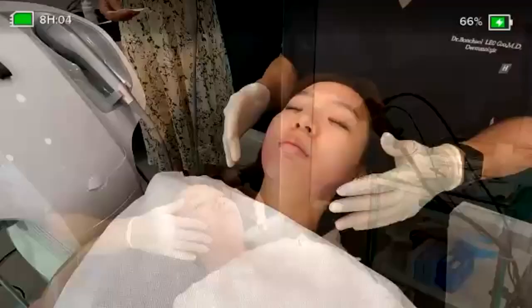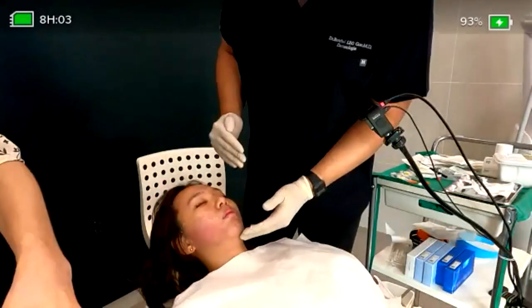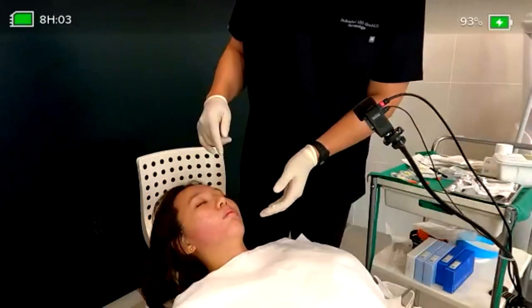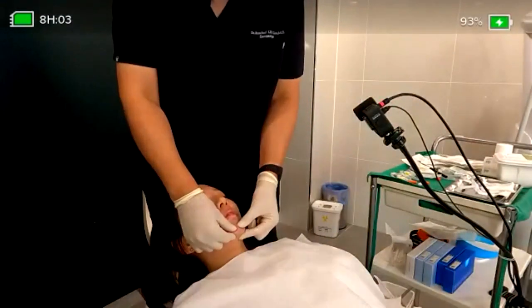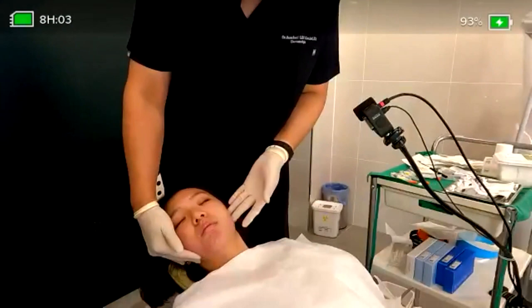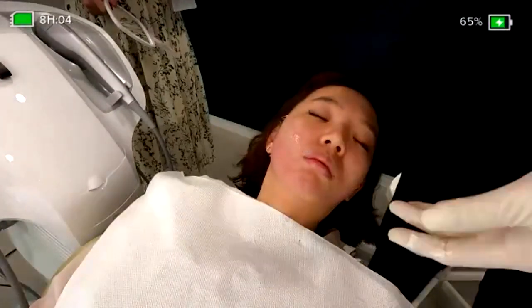So from the start, we can see the differences from this direction, and also from the front, and most importantly, to the patient. So we will go on to another way to do that, but the last step, we are making the chin treatment and the lip treatment will make it perfect. So at this moment, maybe you can just compare here and here. Only changes, we didn't make an injection here. From this to this. Okay.